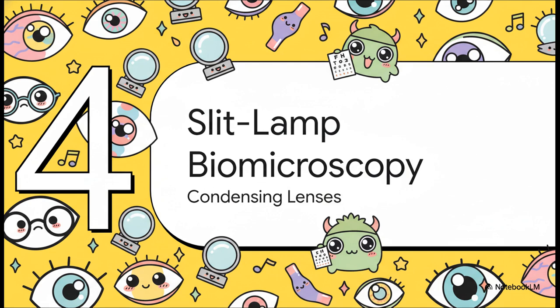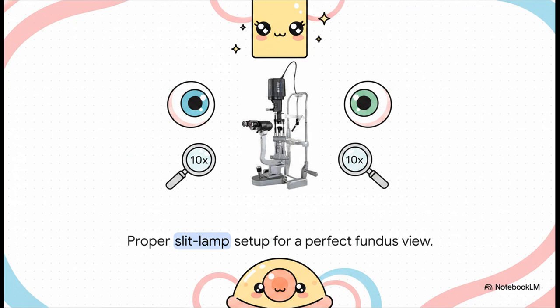Section 4. Slit lamp biomicroscopy and condensing lenses. Now for our final boss level. When you have a symptomatic patient, unexplained reduced visual acuity, or when you just need ultimate stability. If your patient has high myopia or really stubborn cataracts, the slit lamp with a high-plus condensing lens is going to be your absolute best friend. Setup is literally everything here.